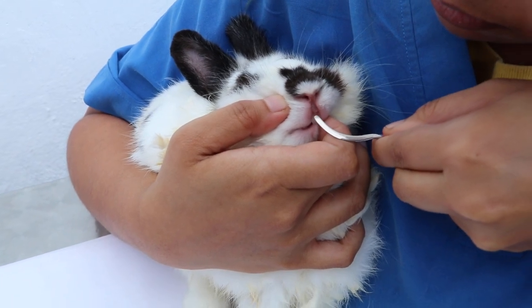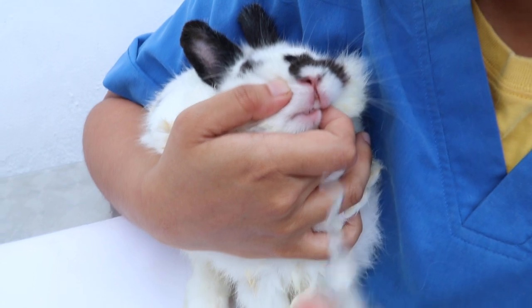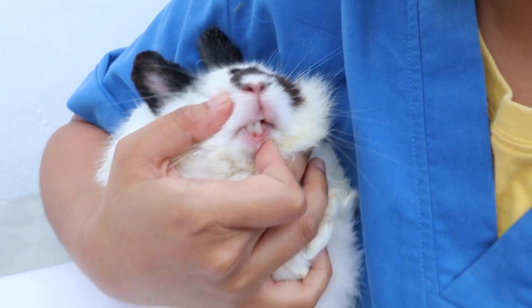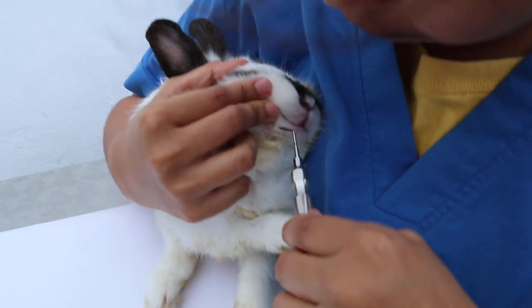The next one is the incisor luxator. The incisor is the front teeth. The luxator is used to loosen the periodontal ligament. It has two ends depending on the angle. The next one is the molar luxator — the molar is for the cheek teeth, the side teeth.